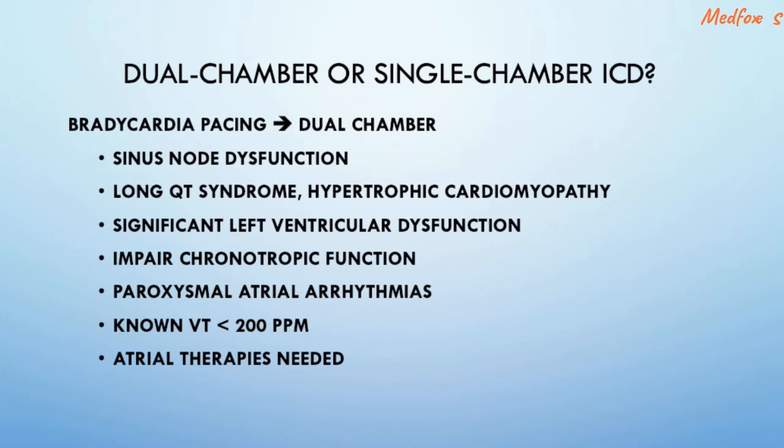They are the need for dual chamber bradycardia pacing, particularly in sinus node dysfunction, which is the strongest indication for dual chamber devices, and specific conditions that may respond to dual chamber pacing, for example long QT syndrome or hypertrophic cardiomyopathy. The next is significant left ventricular dysfunction, assuming that the patient is not a candidate for a CRT, in which case a CRT-D would be selected.